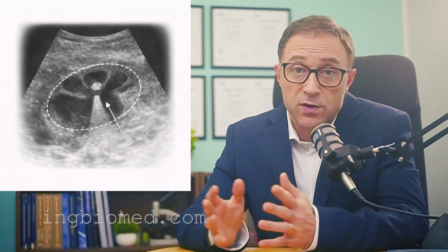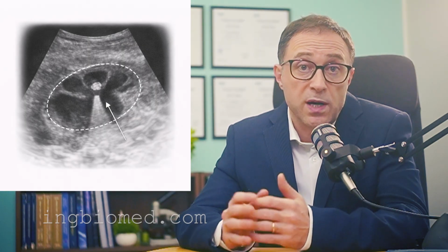Renal calculi present another diagnostic challenge. They appear as hyperechoic foci, often with posterior acoustic shadowing. However, stones located within a non-dilated hyperechoic sinus can be difficult to detect. Careful scanning and identification of acoustic shadowing are essential.